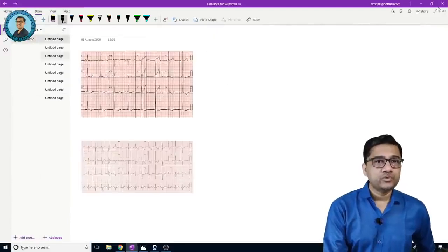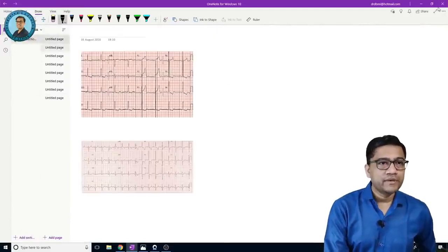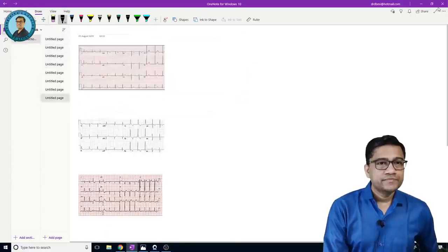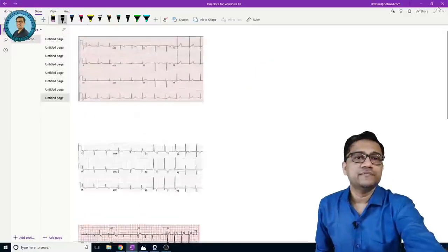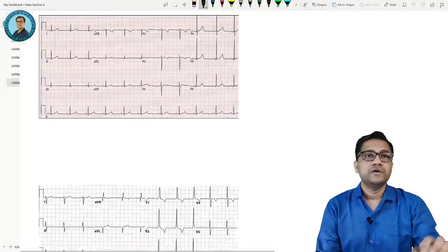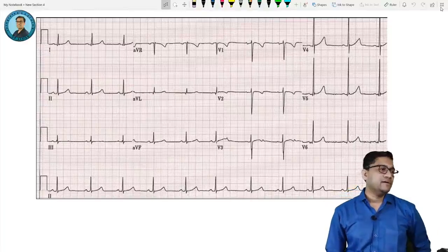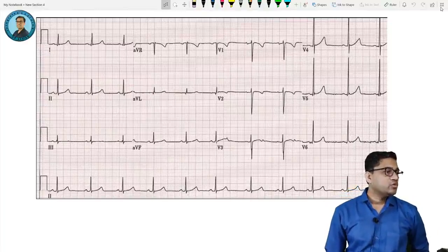Okay. So I'll show you and you tell me. Okay, so I'll start. So please see this. Okay, and what do you see here? Where is lead 2 biggest?